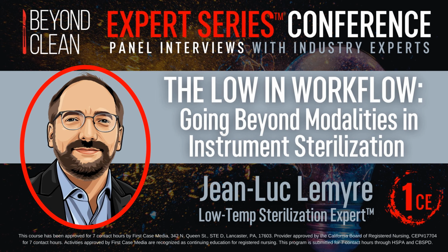As more and more devices go into low temp, it may make sense to have a larger chamber. And I don't think there's a technology limitation there. I know that there are some larger peroxide chambers that exist for industrial sterilization, so it's feasible to do. I don't know that at this point there was sufficient need for the OEM to invest in that, but going into the future, if there's sufficient need from the end user, I think the industry will pick that up and develop these larger chamber peroxide sterilizers.